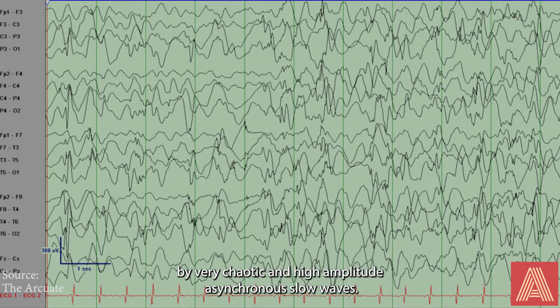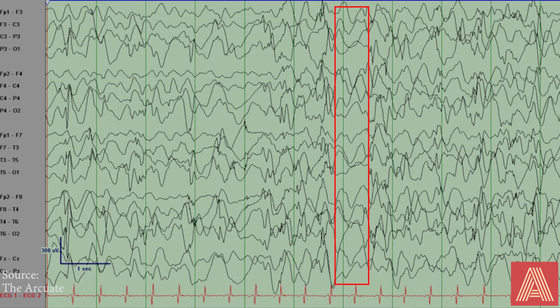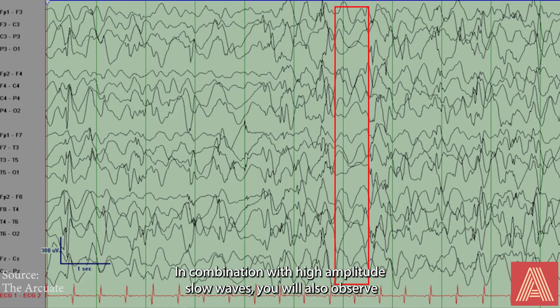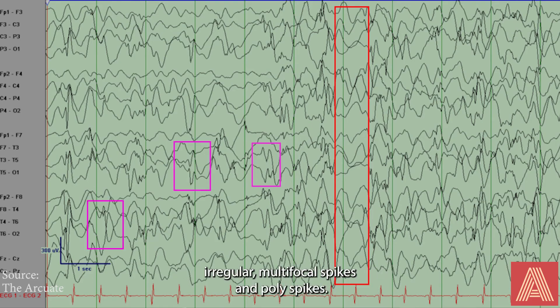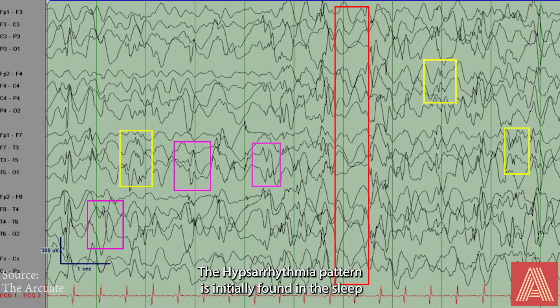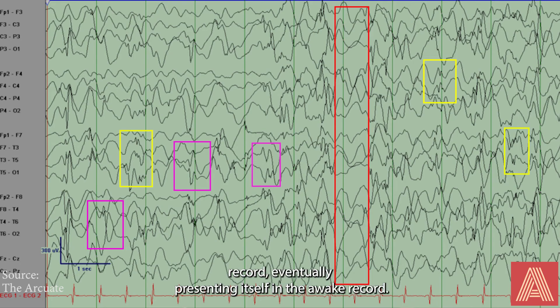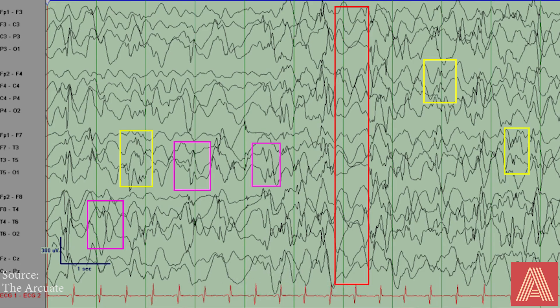Hypsarrhythmia is characterized by very chaotic and high amplitude asynchronous slow waves. In combination with high amplitude slow waves, you will also observe irregular multifocal spikes and polyspikes. The hypsarrhythmia pattern is initially found in the sleep record, eventually presenting itself in the awake record.